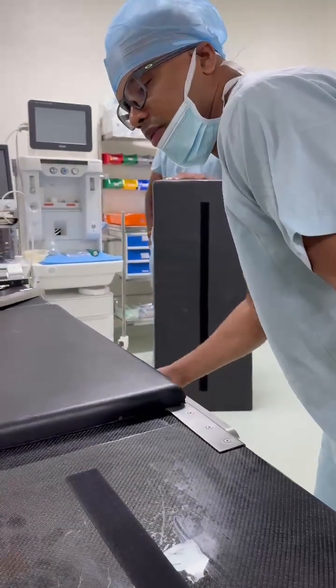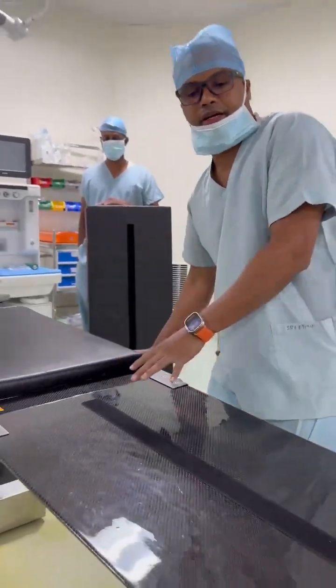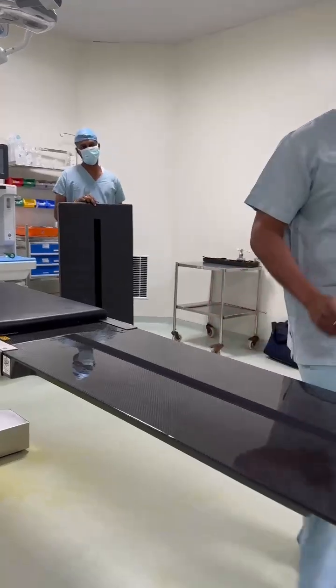Even if you have a different table — so if you don't find the Niro table right now and one is going out — you take this separate carbon fiber extension, take it to another table, and just attach it as it is like this. So you can attach it.